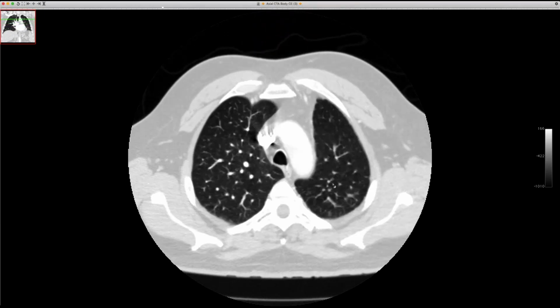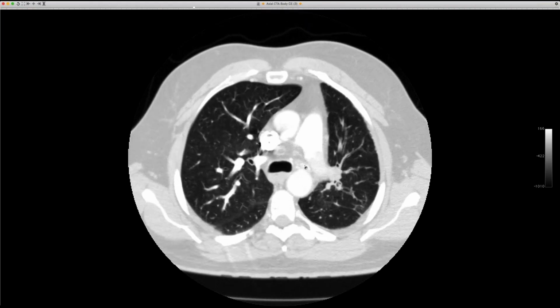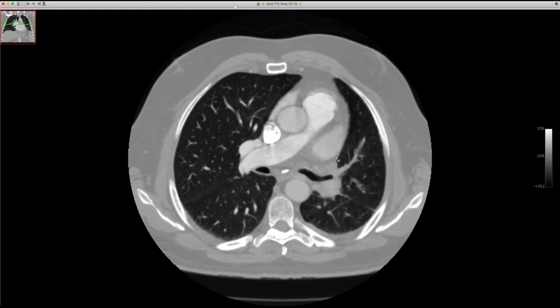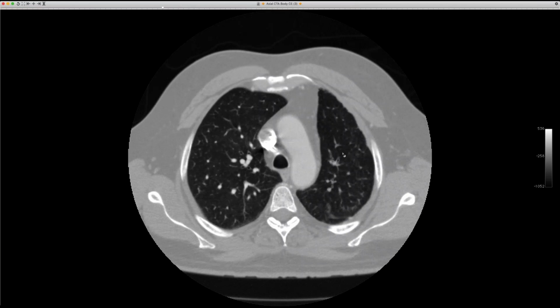So it's a variant of fibrosing mediastinitis. It's a little bit better in that it doesn't get centrally involved, so you don't worry about the cava or things like that. But it is effectively causing a physiologic pneumonectomy. So there's very little flow in and there's no flow out, and even the airways are a little bad. It's presumably from histo as well. Wow.